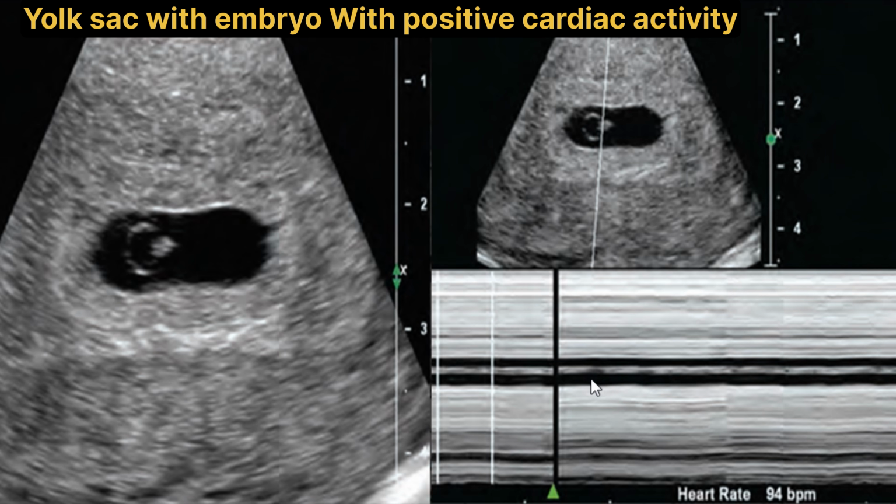As we can see here, the crests and troughs are visualized along this line. These are the features of positive cardiac activity. The embryo's cardiac activity should be documented with M-mode imaging. Doppler should be avoided for documenting the cardiac activity in the first trimester due to the increased ultrasound exposure.